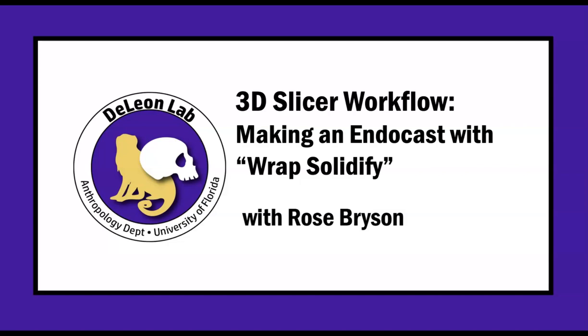Hi, my name is Rose, and today's tutorial will cover how to make an endocast with the WrapSolidify module in 3D Slicer.